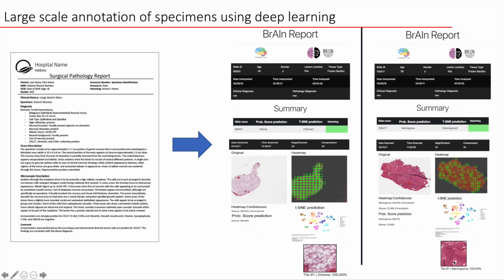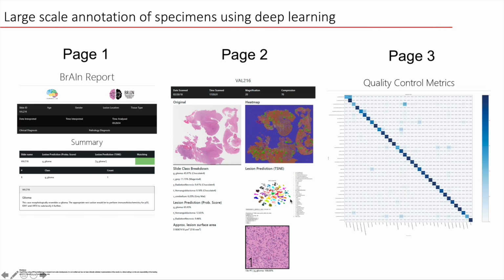You also get a nice picture to accompany your report, so you know what the tumor looks like at high magnification. This is one of our more optimized reports that has much more information. Again, it has a diagnosis on the first page. It tells you what molecular analyses should have been done at a very minimum to help guide you in your tissue selection. So you want to pick cases that have these stains done, as they'll be much more valuable when it comes time to publish, that you've extensively vetted the molecular patterns that are known to exist in these tumors.